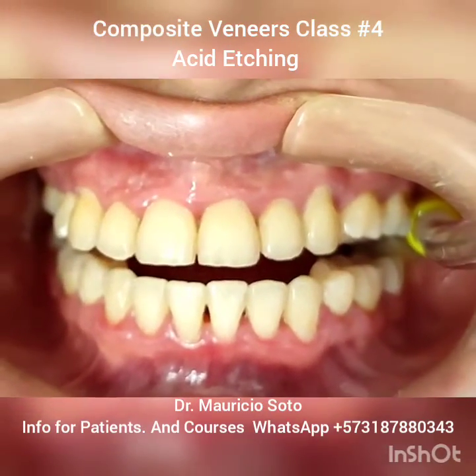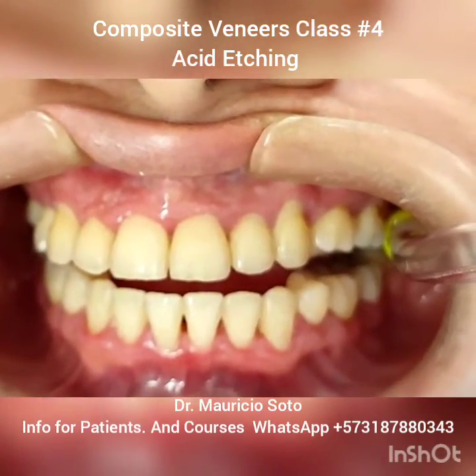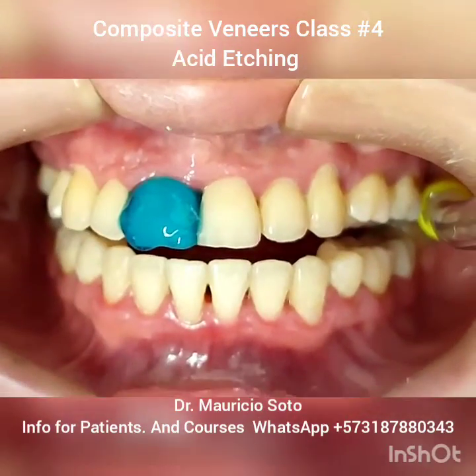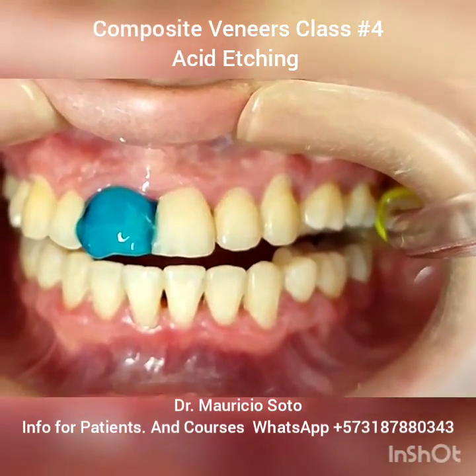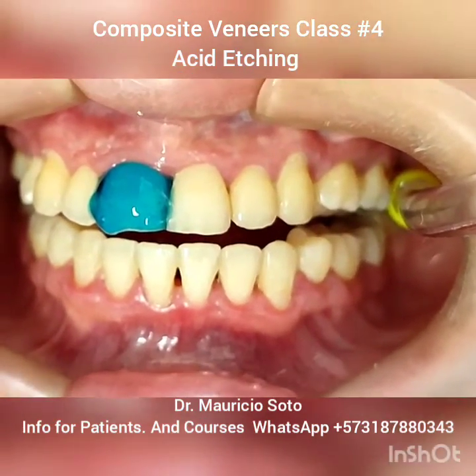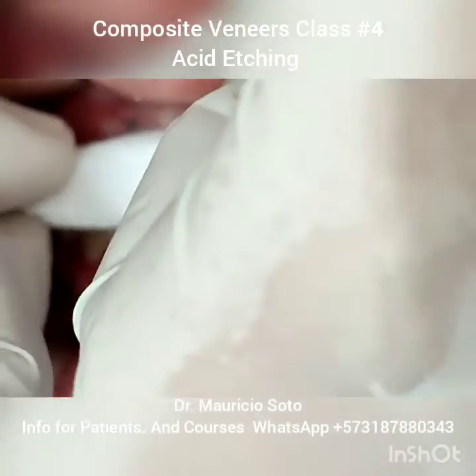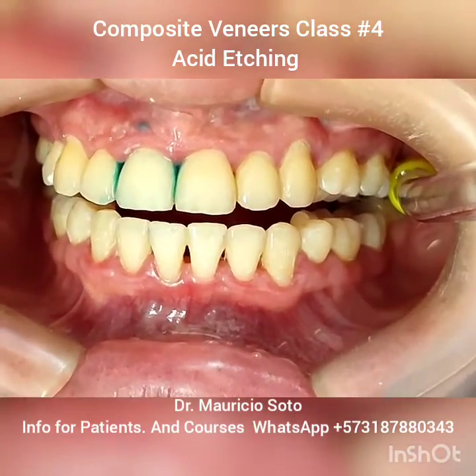After cleaning very well the teeth, we put the acid — phosphoric acid at 37%. The objective of the acid etching is to create microscopic holes in the enamel. We need to leave the acid in place for half a minute, and after this half minute, we remove the acid and clean very well with water.